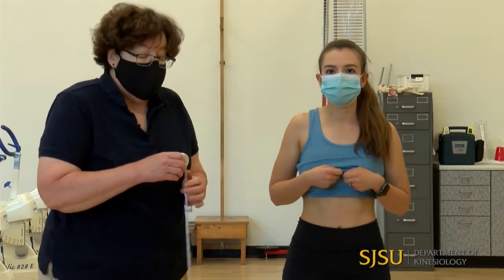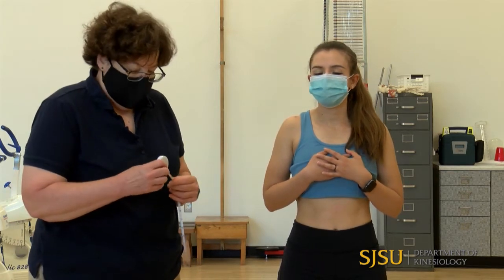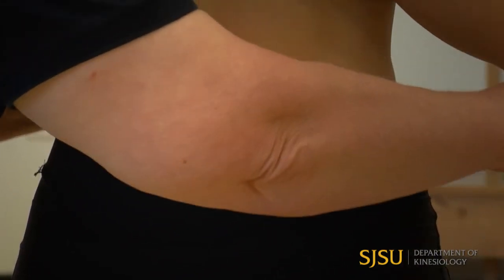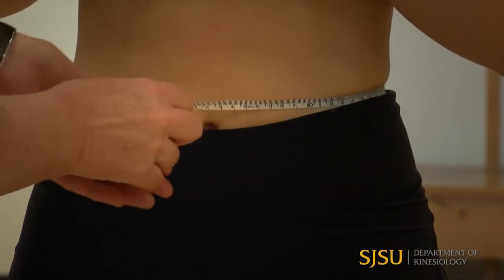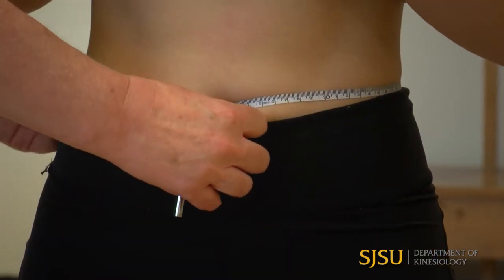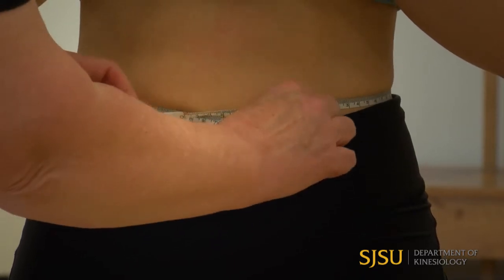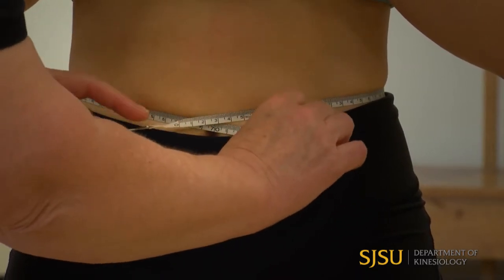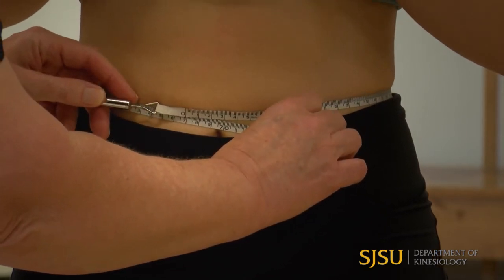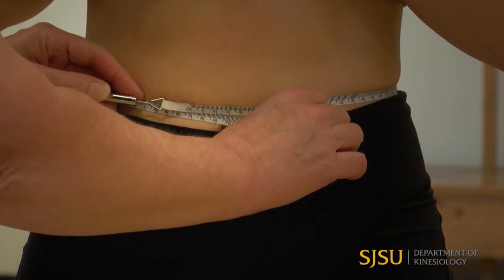There is a second abdominal measurement, which is right at the level of the umbilicus, or the belly button. So we're going to go right over the belly button, get it off the clothing if we can, level right over the belly button. I pull out the Gulick handle and I am at 66.9 centimeters.